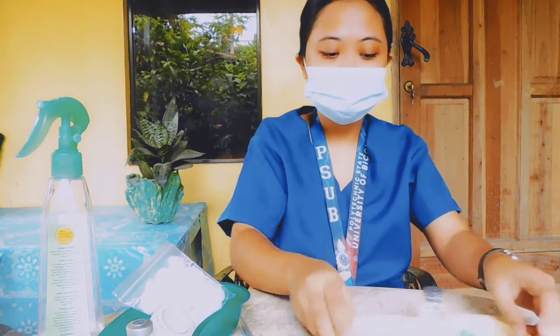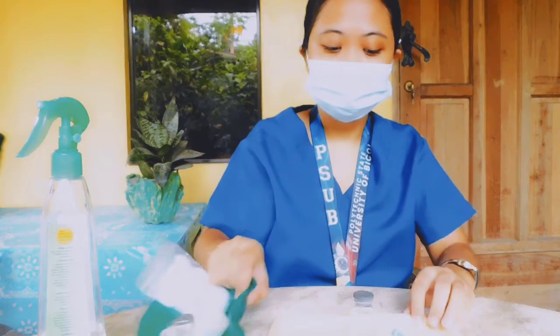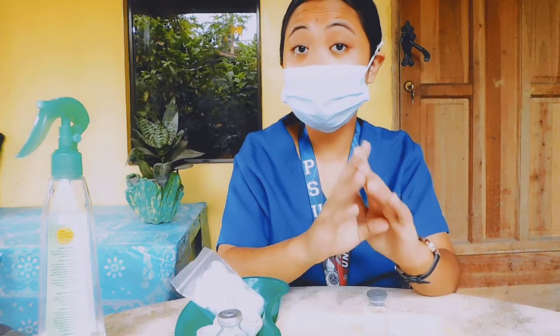And next is organize the equipment. So we need to organize our equipment. And after organizing the equipment, we need to provide hand hygiene, so hand washing and/or sanitizing and donning of gloves, depending on the agency protocol.